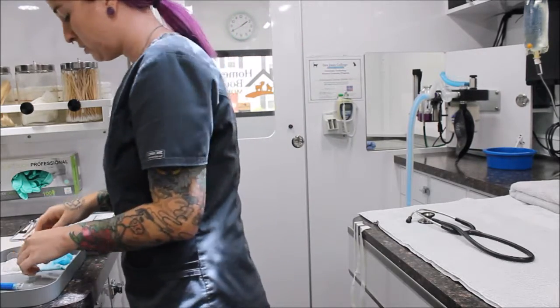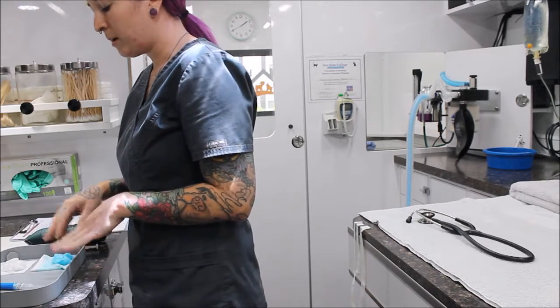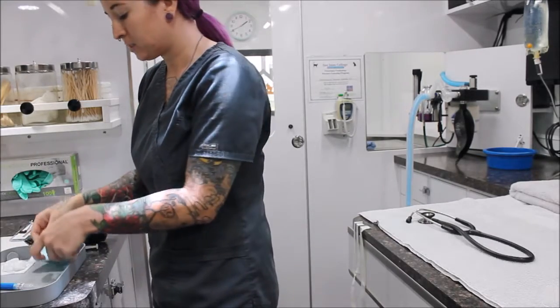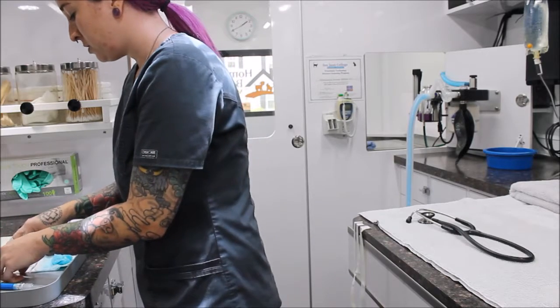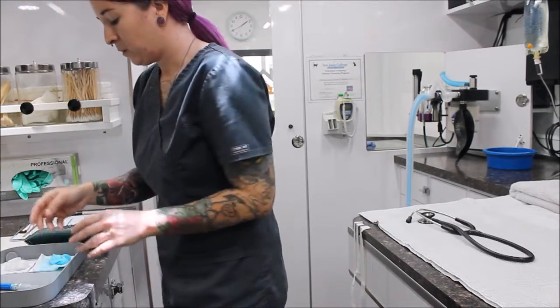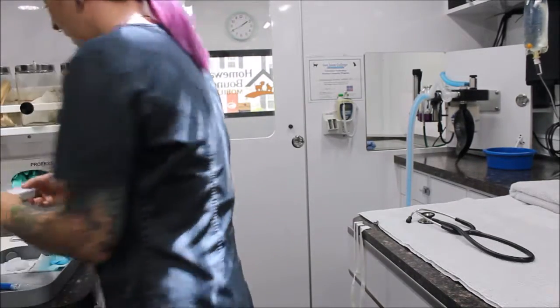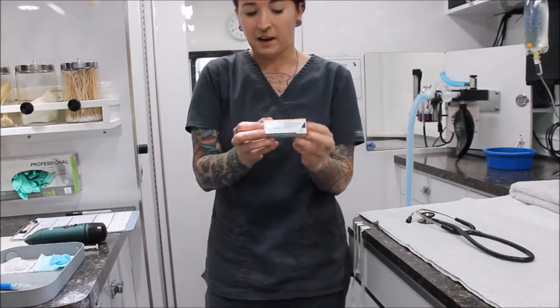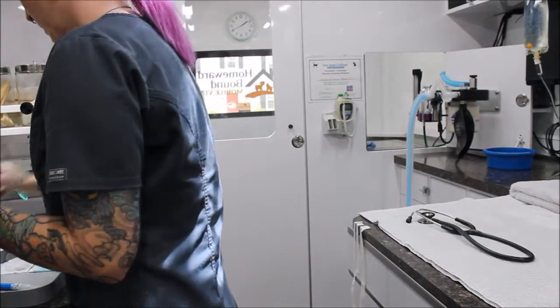Next thing I'm going to do is just make sure that I have the appropriate scrub and rinse available here. So I have my chlorhexidine solution here, and I have my alcohol that we're going to follow it by, just to clean the area before we place the catheter. And we do that 3 times. Next thing I'm going to make sure I have is my Pure Lube eye ointment, just to lubricate the eyes after induction. Don't want our patient's eyes drying out.